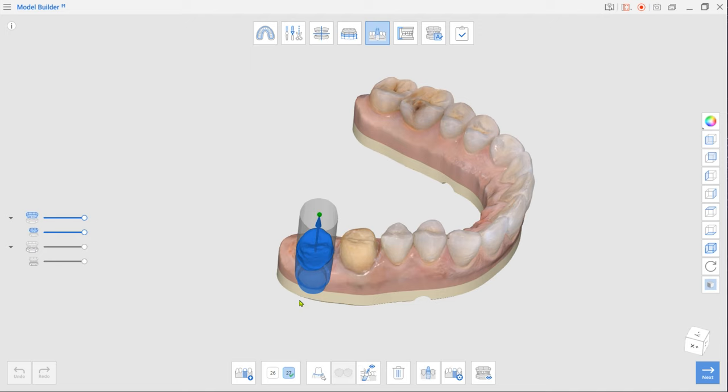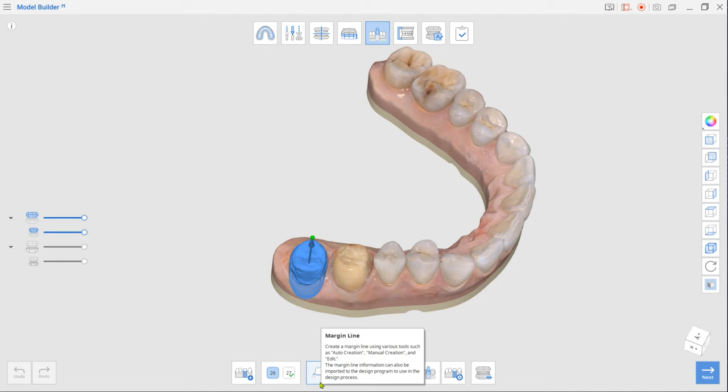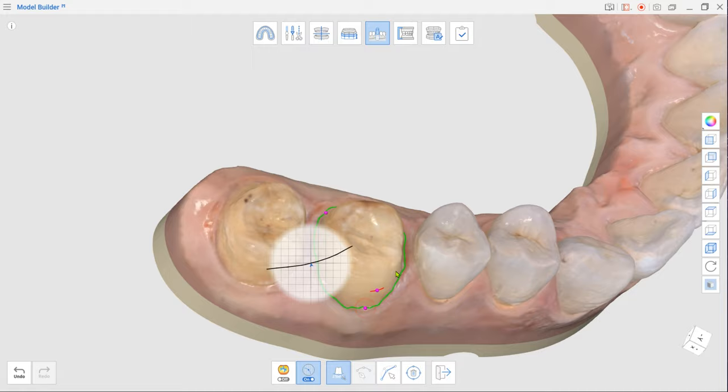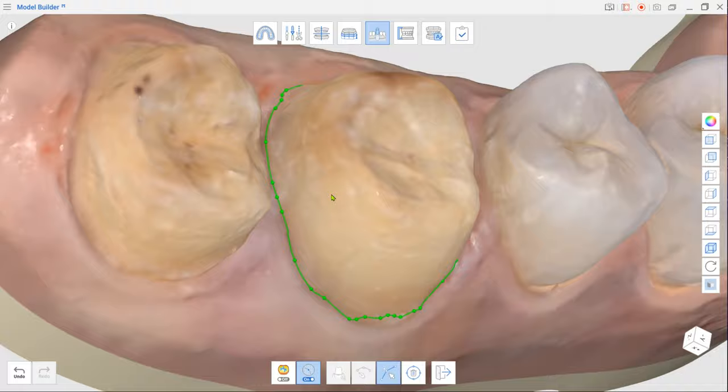If there are no imported margins, first select a tooth number in the toolbox and click Margin Line. Then, in the Margin Line toolbox, select Auto-Creation. Zoom in on the prepped tooth and select a few points on the data. Use the Edit tool to correct the automatically created margin.